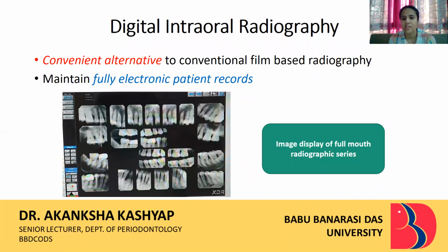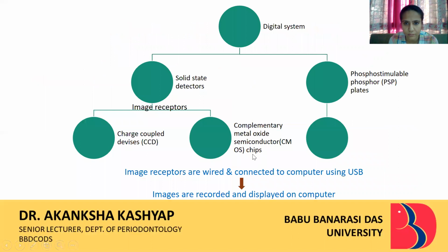Now coming on to the advancements in radiography. Firstly, it is digital intraoral radiography. Digital is computerized radiography. It is a very convenient alternative to conventional film-based radiography. Why? Because it maintains fully electronic patient records. Here you can see the image display of a full mouth radiographic series by digital intraoral radiography.